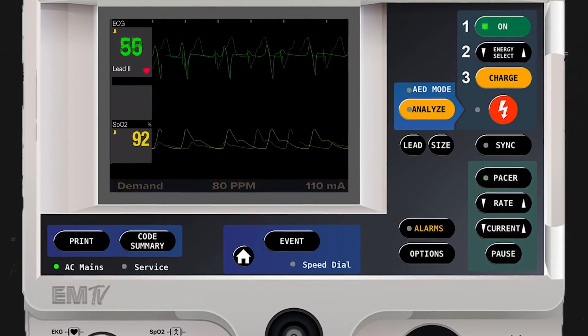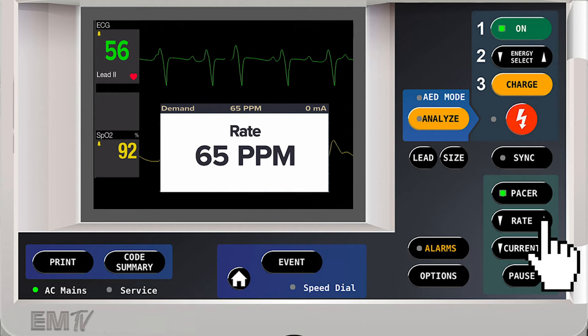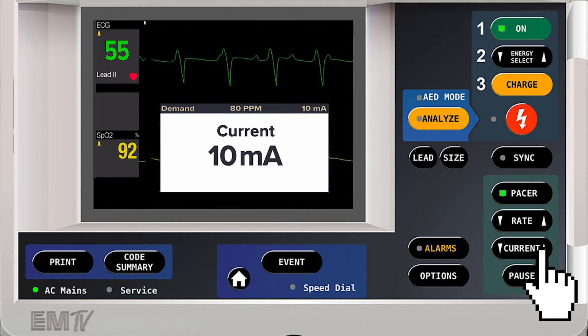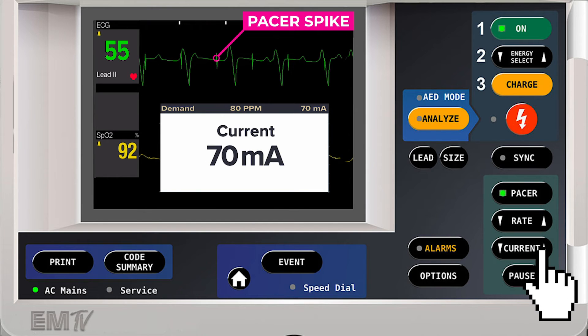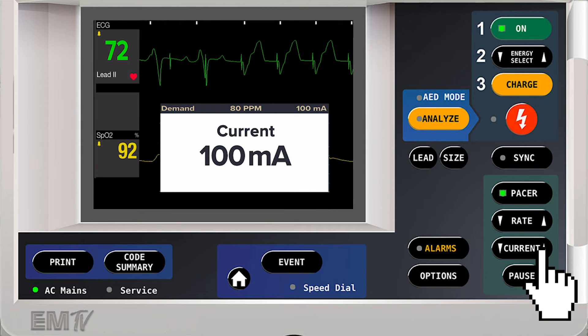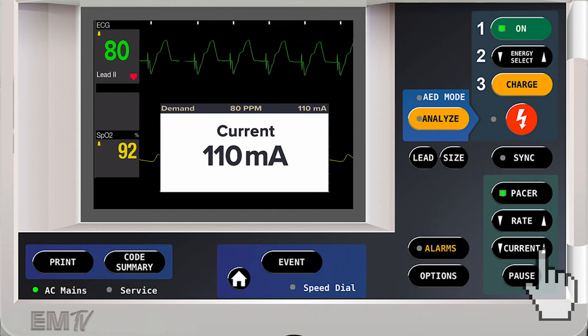Alternatively, pacing can also be performed without using the jog wheel. I'll activate the pacer function, and then use the right or left side of the rate button to set the rate at which I want to perform pacing. I'll then press the left or right side of the current button to begin delivering energy, continuing to increase the current until I achieve electrical capture. Once I see this occur, I'll increase the milliamperage 10 more. I will check a pulse to determine whether or not mechanical capture has been achieved.